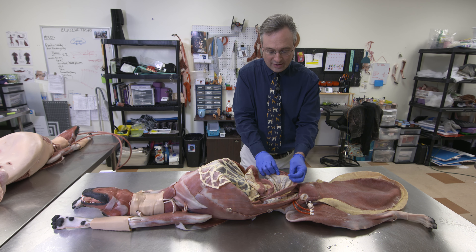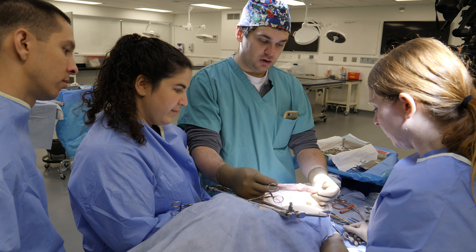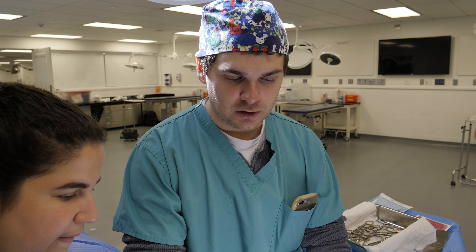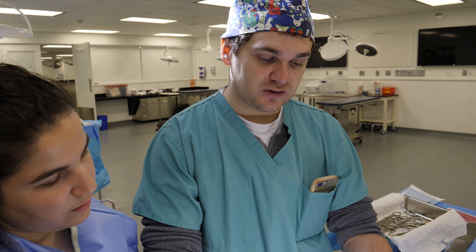This would guide us to consider this area for an anastomosis. The most critical question is the preservation of blood supply. I think with a resection-anastomosis, the two hardest things to figure out are: where to cut and what blood supply to save.